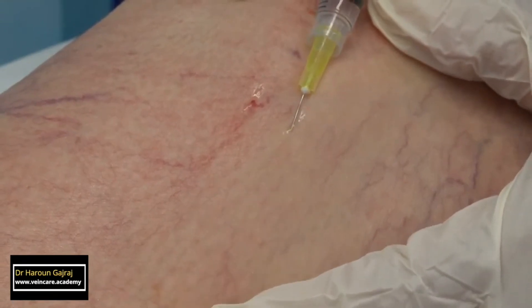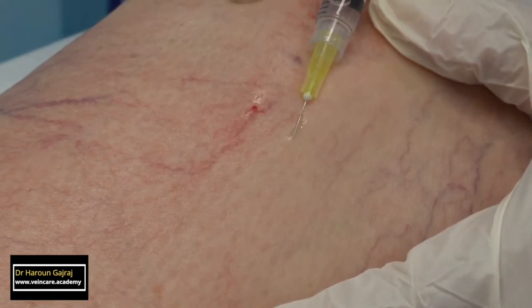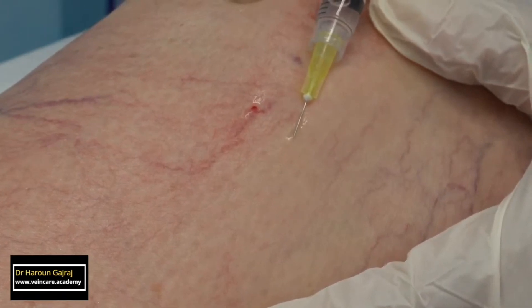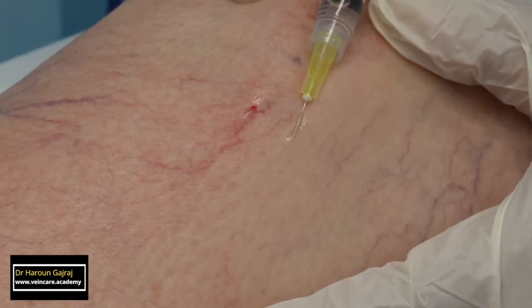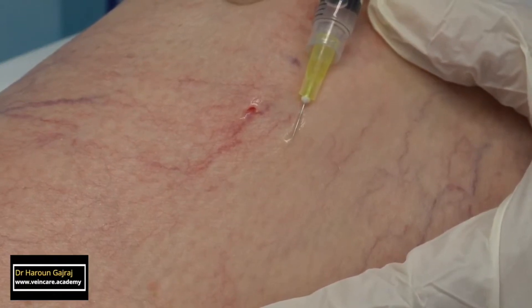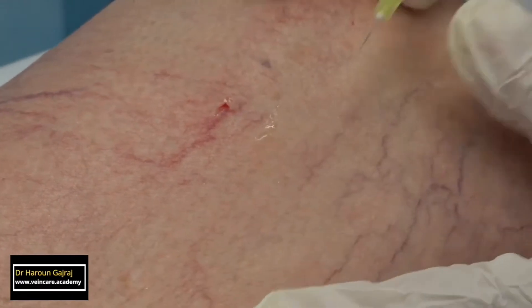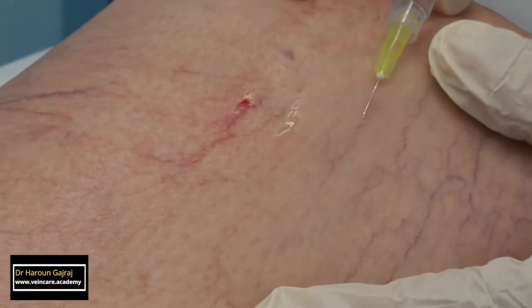The needle tip should be observed at all times. The injection must be stopped immediately if a bleb appears, which indicates extravasation, or if there is blanching of the skin — in contrast to blanching of the vessels — which indicates veno-arteriolar reflex venospasm, or injection directly into a small arteriole.